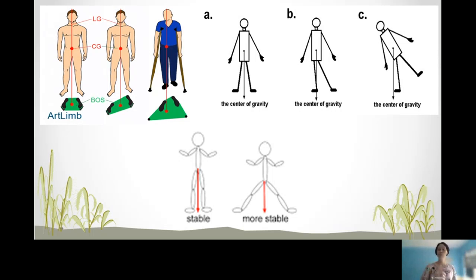And finally, number 3 on this point is be close to them when they start. Be sure to put the chair close and ready before you ask them to stand up for safety. When they start walking, be on their side and slightly to the back. Be sure to be very close to make sure they walk safely.